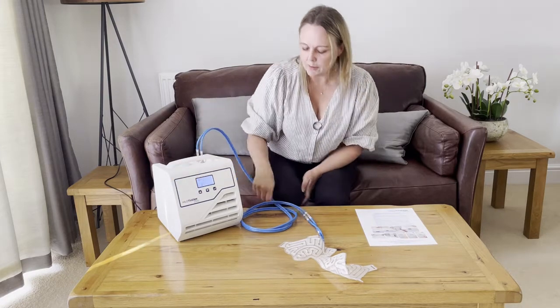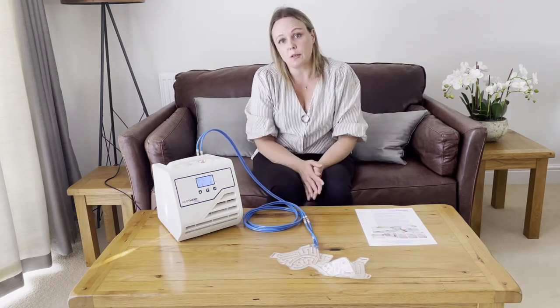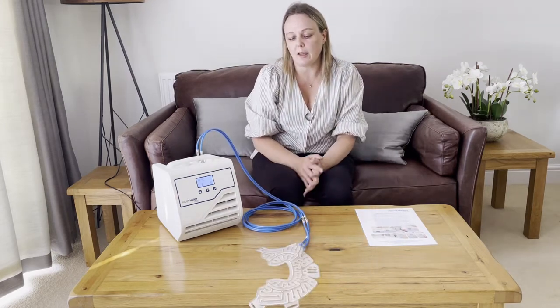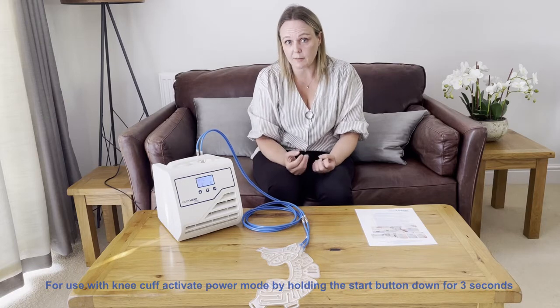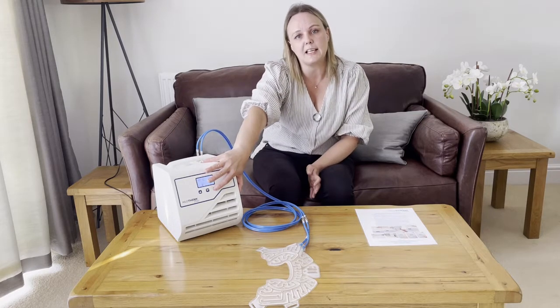Once you've adjusted the temperature and got everything connected, you can start the water flow. We have a few different models of HTP-1 — some are used for facial surgery and some for orthopaedic surgery. For face surgery you can use eco mode by pressing start quickly. But for orthopaedic cuffs, you need to activate the power or boost mode by pressing and holding start for at least three seconds. If you're using a knee cuff or large orthopaedic cuff and just press start quickly, there won't be enough water flowing through.